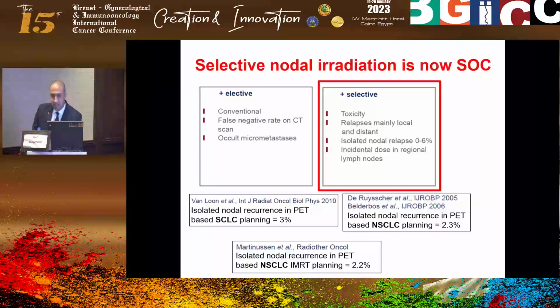The reason is, if you are doing SBRT, even if the amplitude is more than a centimeter, the target is usually quite small. But if you have super huge volumes, sometimes it does make a little bit of a difference, particularly in patients who have borderline lung functions. It does introduce a little bit of complexity for the patient because a lot of the patients are quite frail, and doing abdominal compression sometimes is not that easy.